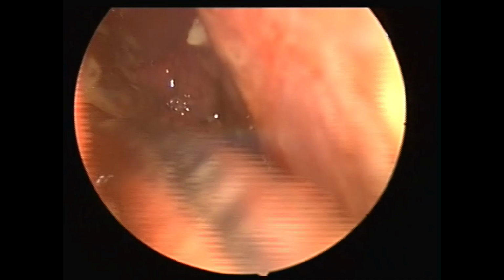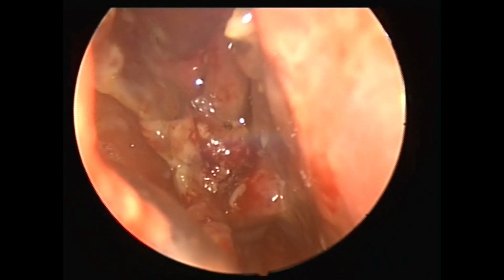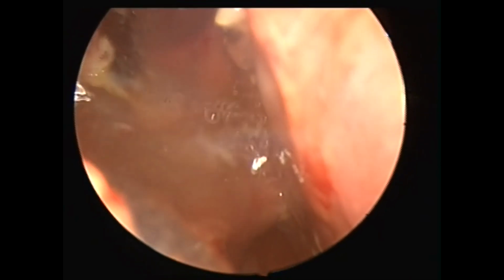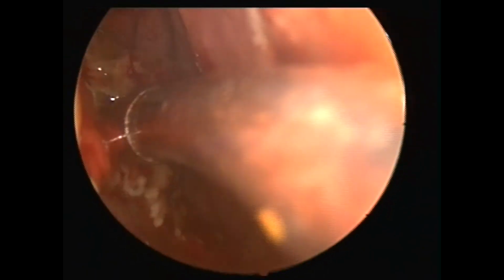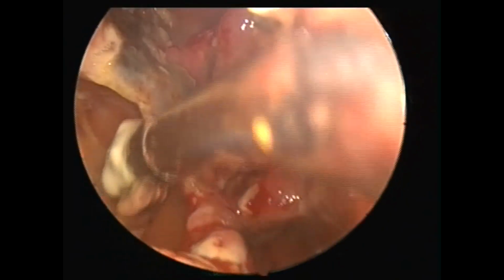I'm taking my curved suction and trying to give a thorough steroid nasal wash inside the sinus. You can see how big of an opening we have achieved in this patient's right side maxillary sinus. I'm going to suction that again. Whatever washes I'm doing, we're supposed to give thorough, constant steroidal washes. I'm using Ringer's lactate, 500 ml of Ringer's lactate mixed with 4 to 5 respules of budesonide, 0.25 mg budesonide.